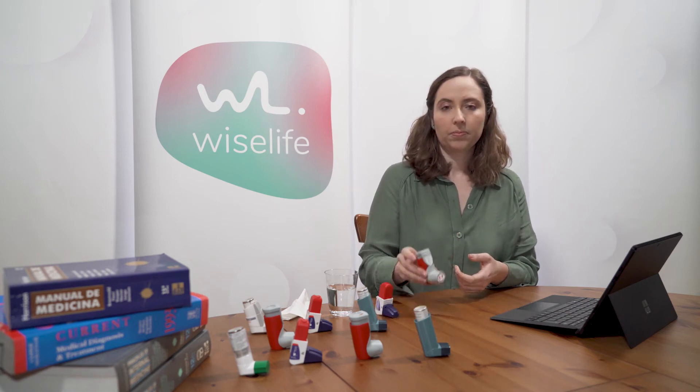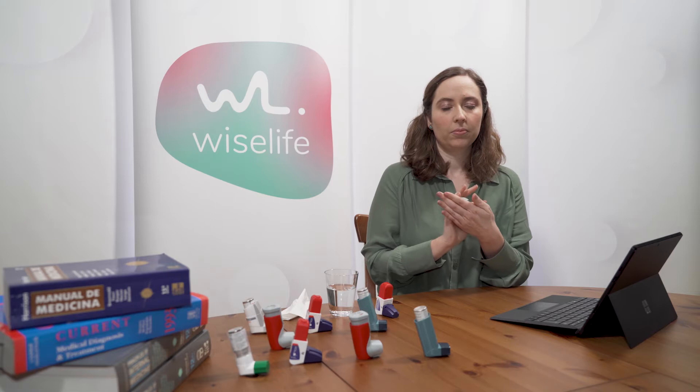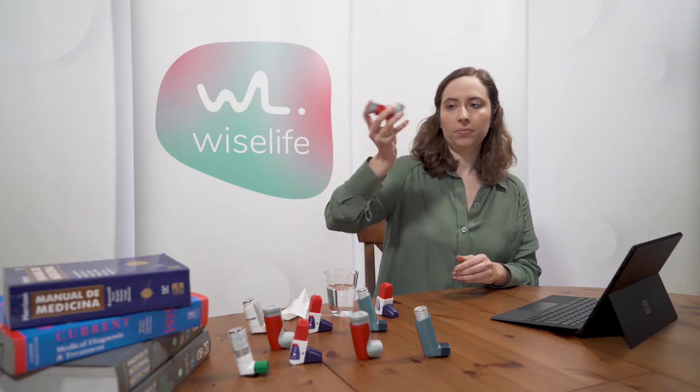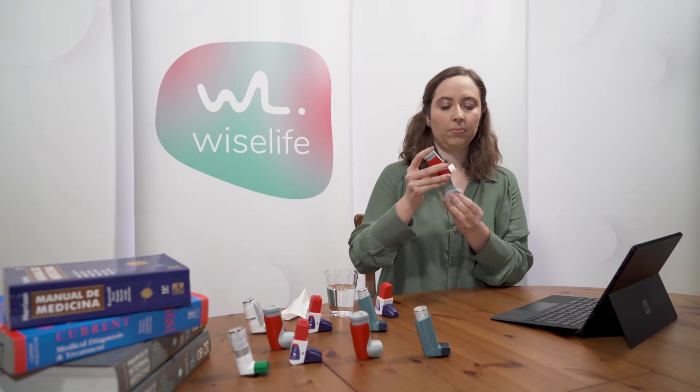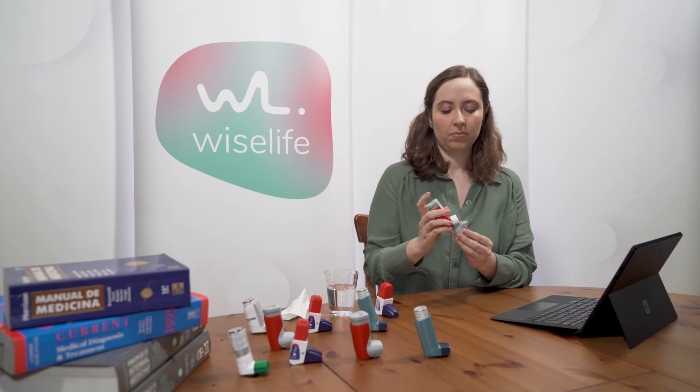When using the Rappi Ailer for the first time, you will have to prepare it. You should also do so if you drop the device or if it has not been used for more than seven days. Warm up the device to body temperature and shake it for five seconds. Remove the cover and press the counter to waste one dose. Wait ten seconds and press it again to waste a second dose. Your device is now ready to use.